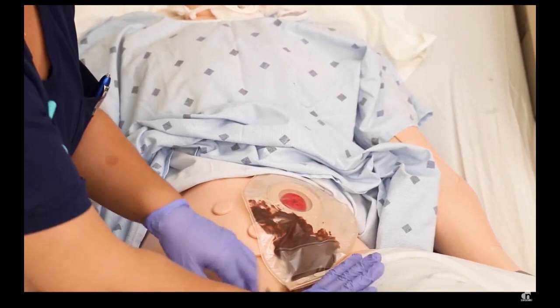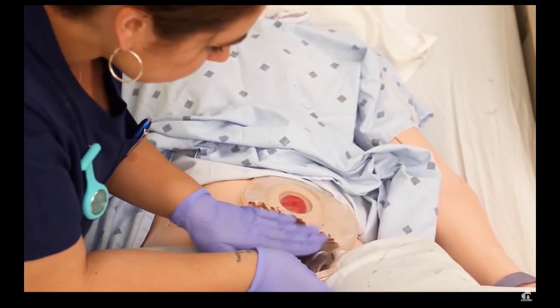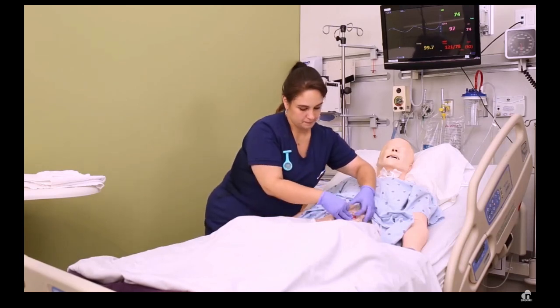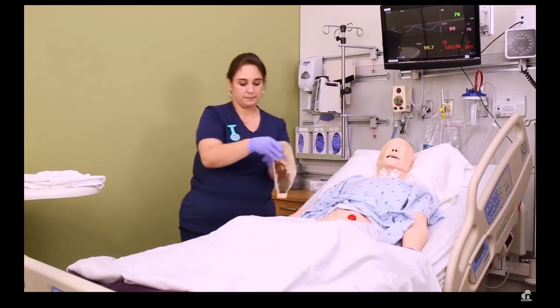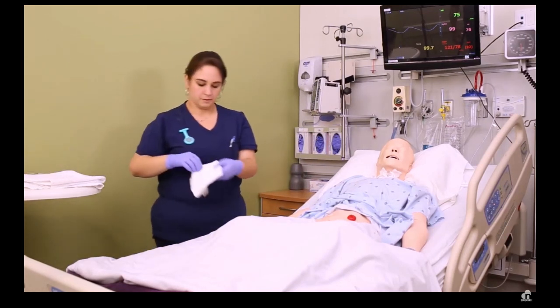And then the first thing you want to do is assess the output from the stoma. So if you have a clear bag, you can actually see the output through the bag and visualize it that way. Otherwise, you'll need to empty it. In order to clean and assess the stoma, we have to remove the bag. So start by peeling the wafer and just pushing the skin down away from it gently. You might need to use warm water or alcohol here if the adhesive is tough.